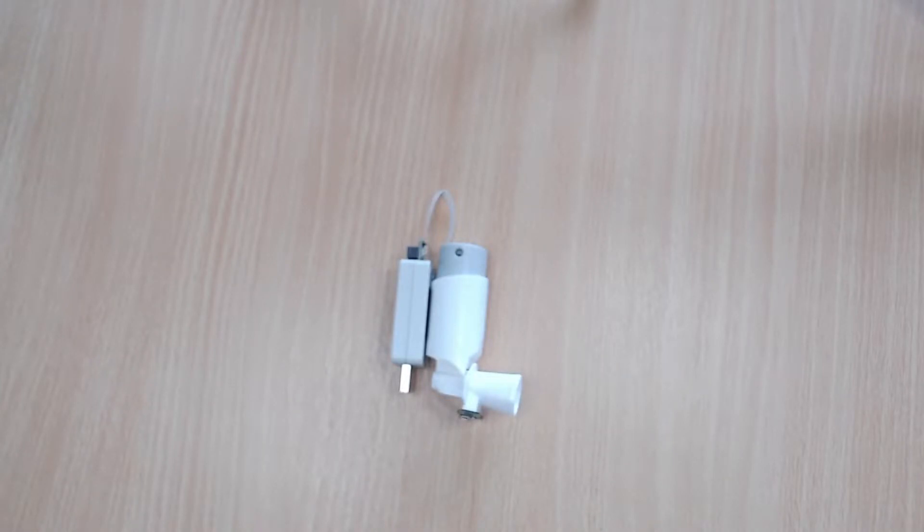Hi everyone. Today we're going to be looking at how the FLS110 can be used to measure the mass flow through an asthma inhaler.